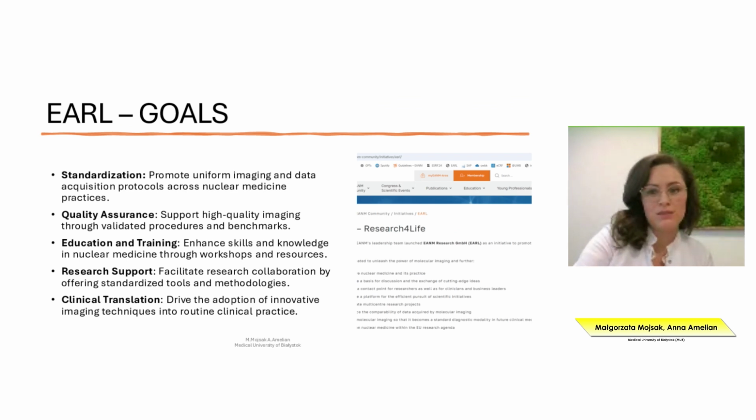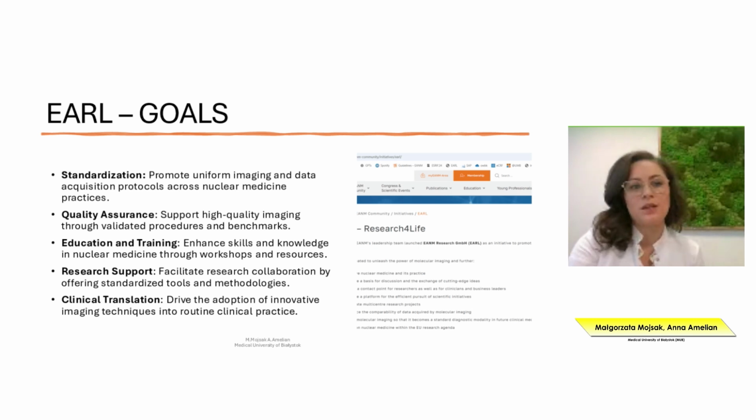What is the goal of the accreditation initiative? As I said before, the main goal is to provide standardization to promote uniform imaging and data acquisition protocols in all nuclear medicine practices. Then quality assurance: we need to make sure that the images are of top quality.